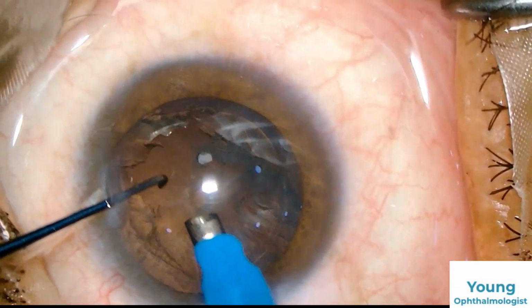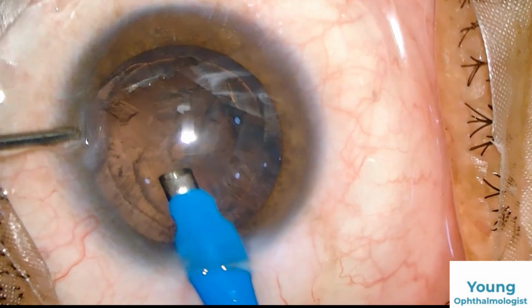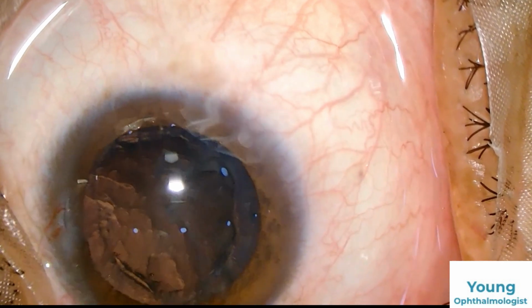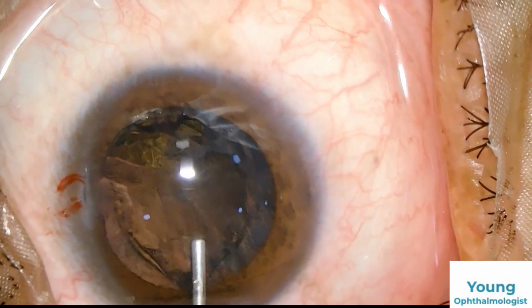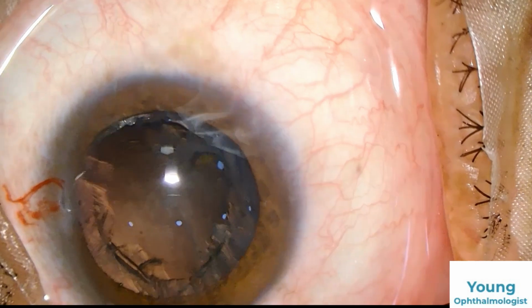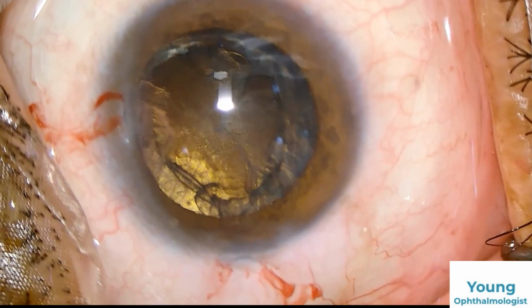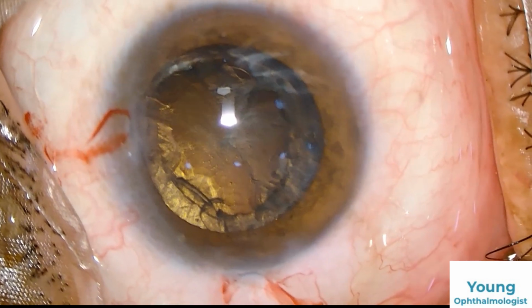Phaco 2 is completed, complete epinucleus and nucleus is removed. Here I am seeing a small component of posterior polar. For safety, before taking out the phaco probe, I am injecting visco. Whenever you have any doubt that there is a posterior subcapsular cataract with a polar component and the patient is diabetic, having multiple intravitreal injections, you should take care that there should be no PC rent. It will deteriorate the retinal condition, will increase the edema and have a long-term effect on the patient's vision.